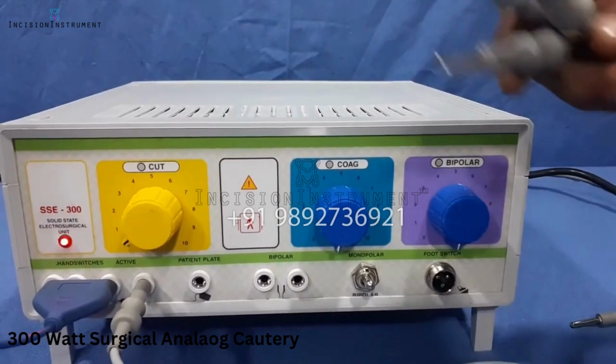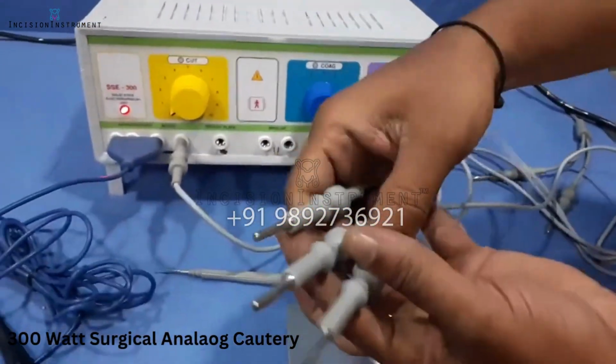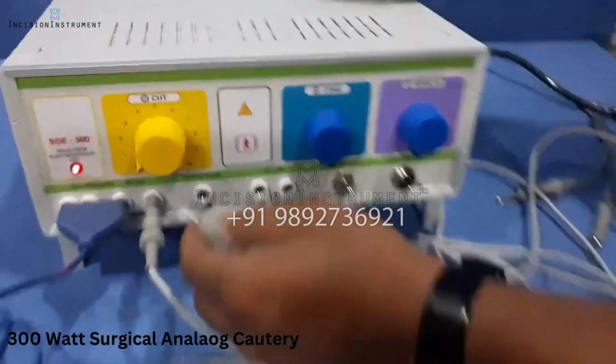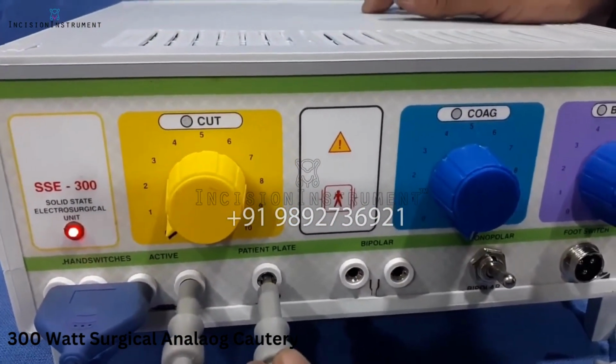The patient plate cable cord is given like this. On one side you will get a 2 banana jack pin, which you have to connect to the patient plate. A single port is here, you can find it in the machine. This is for the patient plate. The single pin you have to insert here.